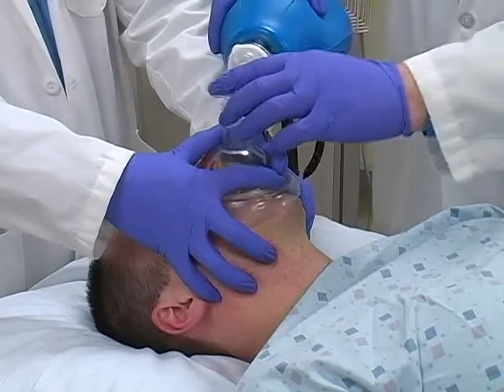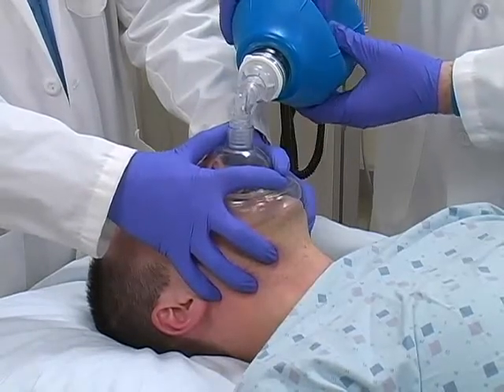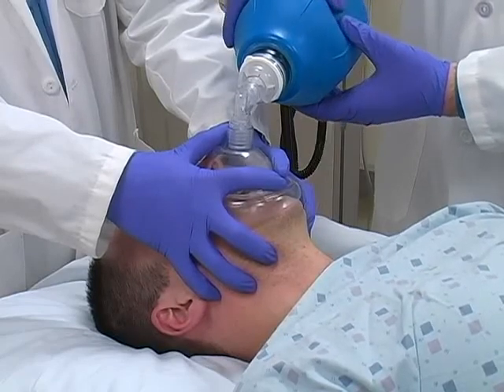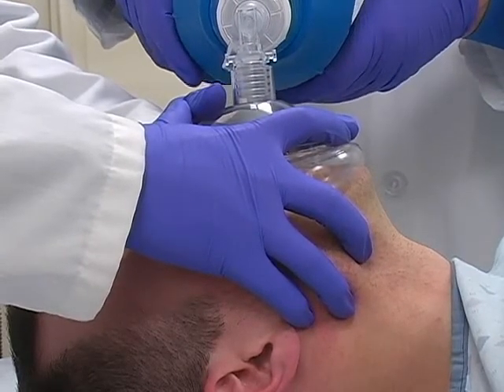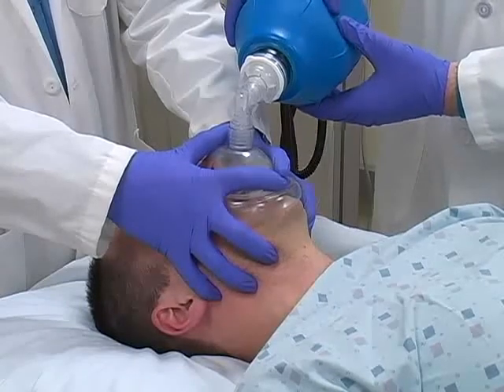Once a proper seal is achieved, the second provider attaches the bag to the mask and begins ventilation. Note that the first clinician may provide a head tilt and a jaw thrust maneuver while holding the mask onto the patient's face. Observe for proper chest rise during ventilations.